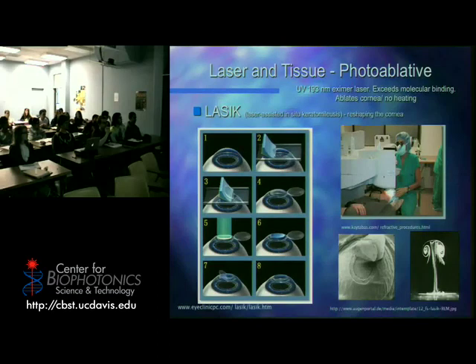You see this part. You see the blade. It's not very well in focus. That's the part that bugs me the most. The laser part doesn't bug me. The part of the knife going across and slicing the cornea, that's the part that kind of irritates me.